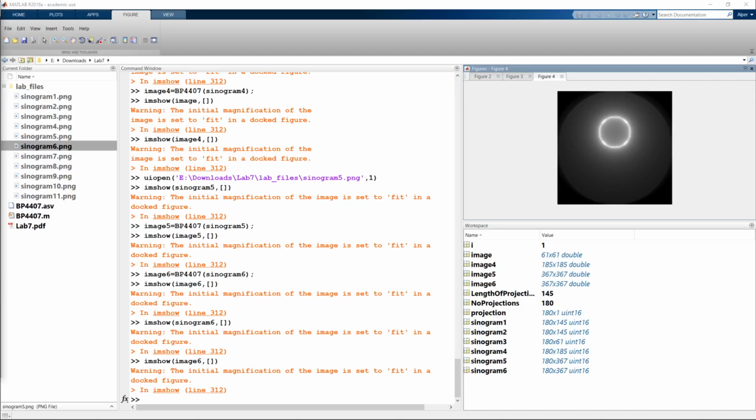As we have observed, our sinogram generated images are somewhat blurred due to the oversampling of low frequency components in the back projection process, and this oversampling creates a blurring, smearing effect over the image.